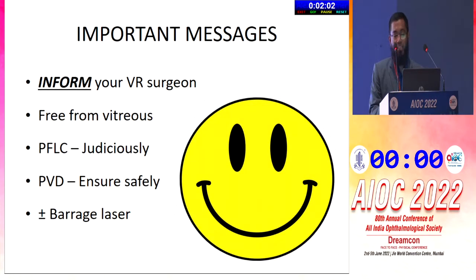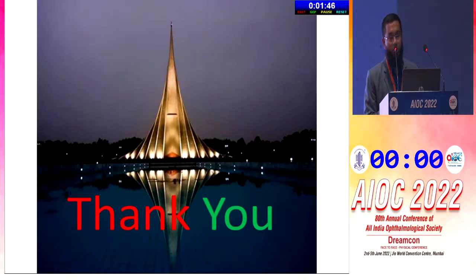So the important message regarding this scenario is that the VR surgeon should be informed, and before removing the dropped nucleus, it should be freed from the vitreous. PFCL should be used judiciously, and PVD we have to induce safely. And definitely I prefer to go for barrage laser. Thank you so much.